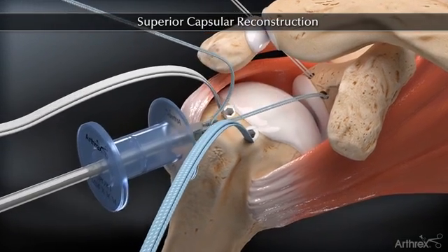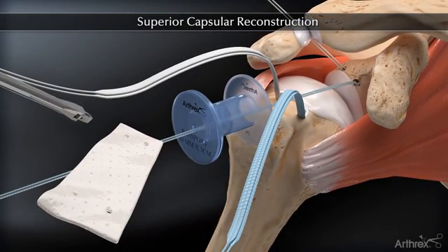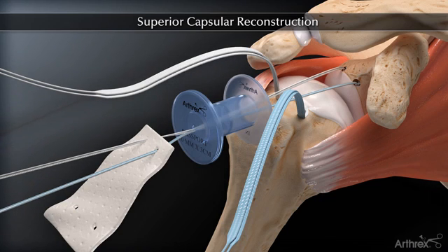The fiber wire sutures are systematically retrieved through the passport cannula and passed through the corresponding holes in the graft. Careful attention to suture management is critical at this point to avoid suture twists while retrieving and passing the sutures.